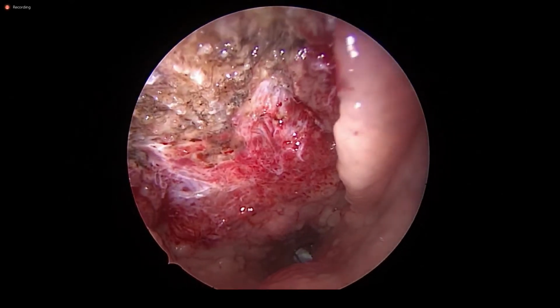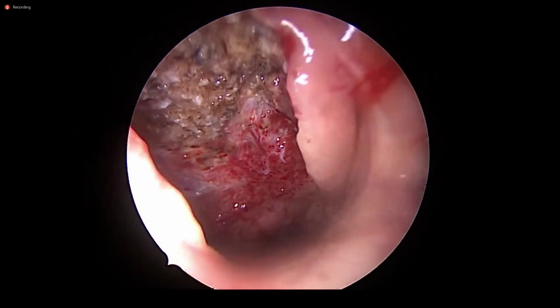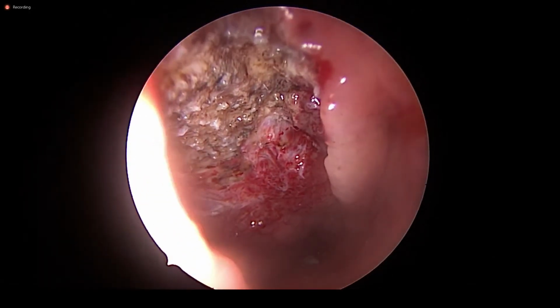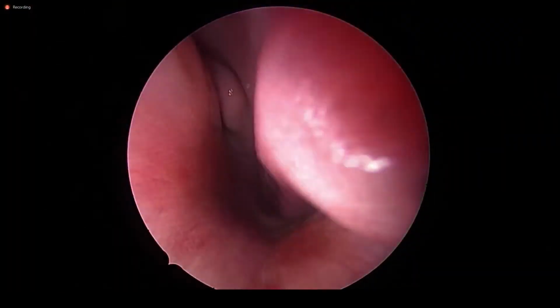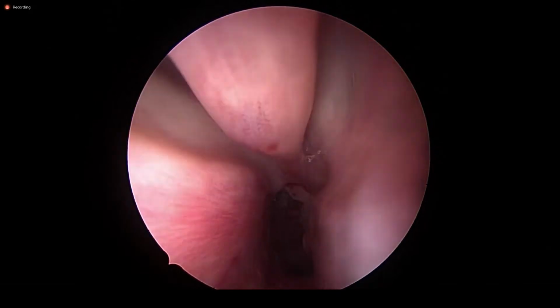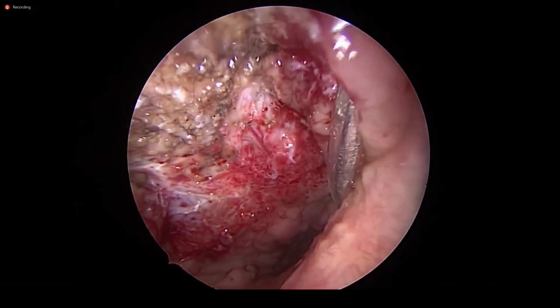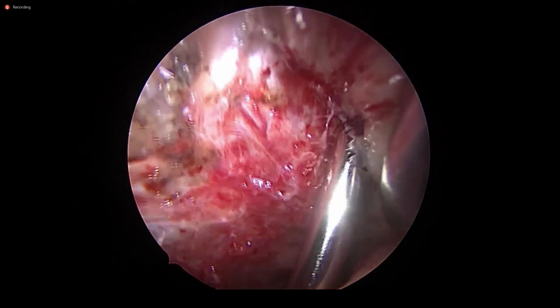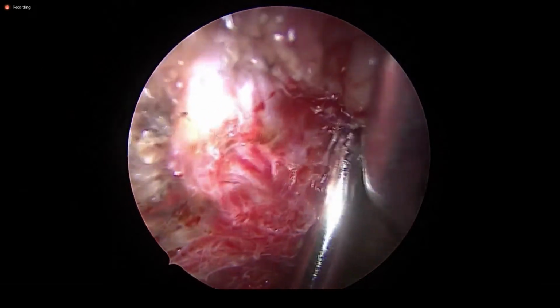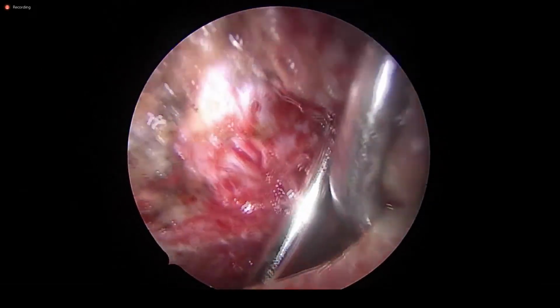Now the third phase. The third phase is the laterally hypertrophic adenoids. How can you see this? This is very, very important, as these are responsible for the ear problems. They can regrow and obliterate the space. Can you see this? Yes, sir. We are seeing the laterally hypertrophic adenoids. See the chunk of tissue. The fear is damage to the vessels and all. Let me tell you our technique, the simplest.